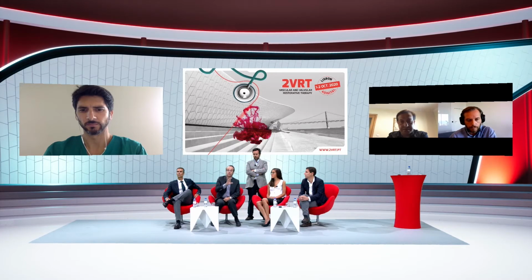So anticipate and choose your valve accordingly. If you have problems with the valve, I know it's 30,000 euros, but you'd better save the patient. If the patient is awake, which I don't know if in the case was, and the patient complains, I really pay attention to the patient. If he complains, the aorta is talking to you. So listen to the aorta. Don't force if the patient is complaining.